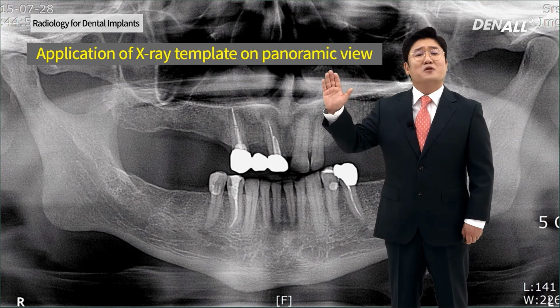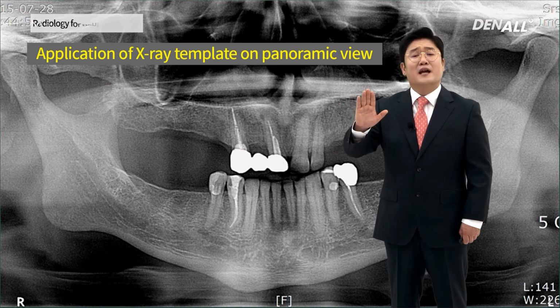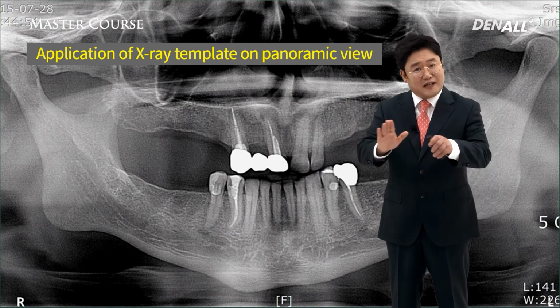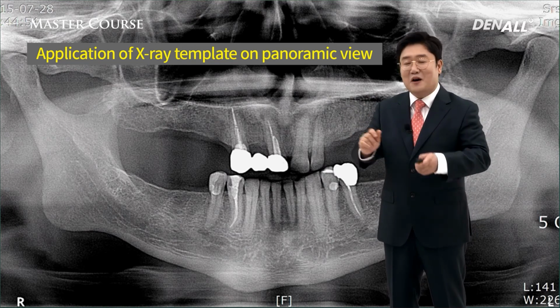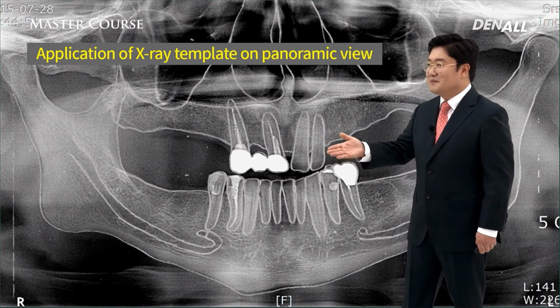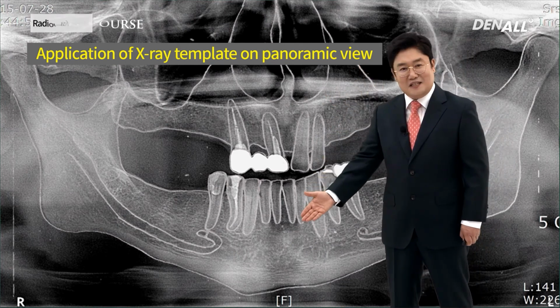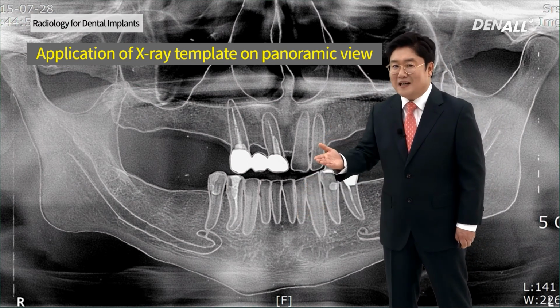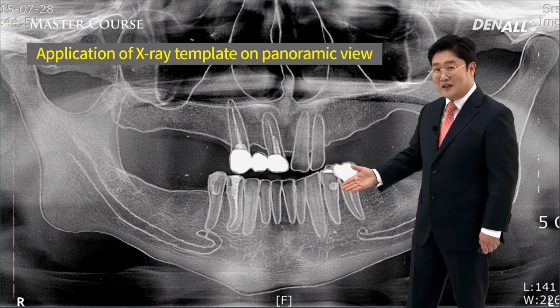The first thing we had to do was to take panorama pictures because panorama pictures were the basis of all implant procedures. After panorama is taken, the pictures are developed and transparent paper is put over it, and with sharp pencil, tracing is done. By tracing, we can identify teeth, bone, maxillary sinuses, and inferior alveolar nerve running canal. Not only that, the regions where implants will be placed, the bone height is measured.